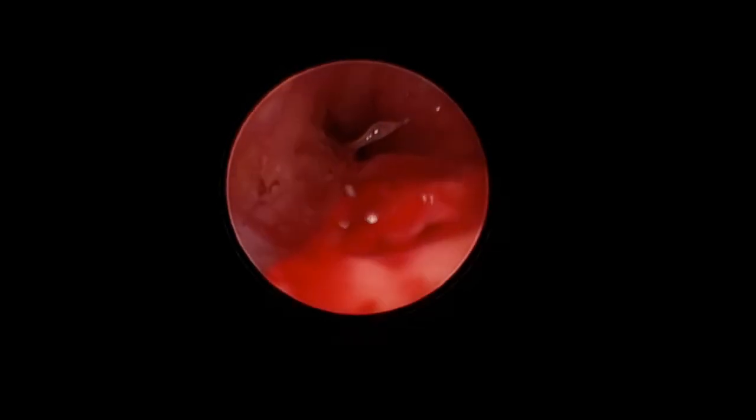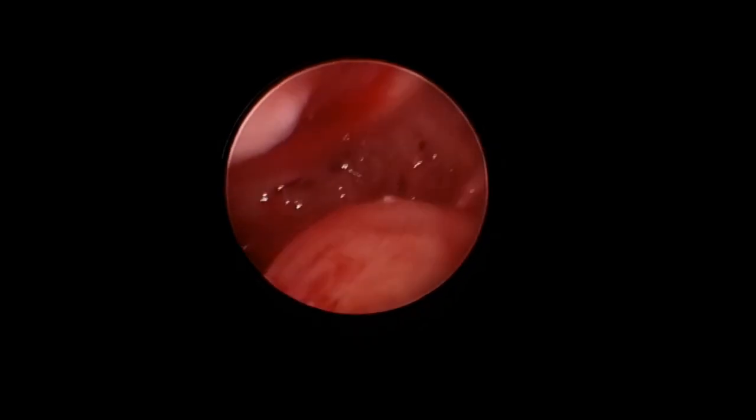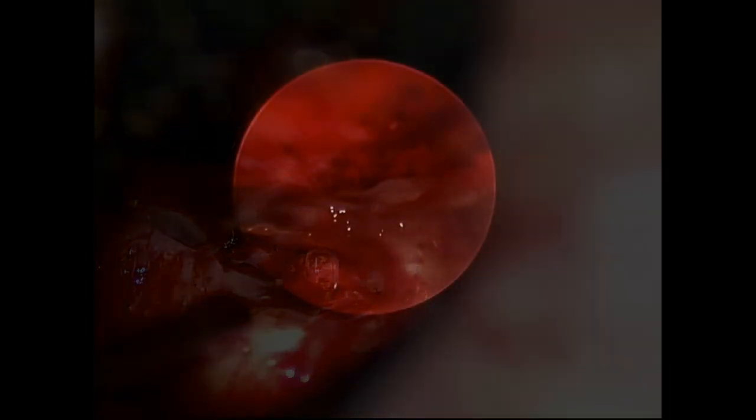There is air there, and there is some reformation of mucosalization. There's the promontory, and you can see the undersurface of the cartilage graft, and you can see nicely into the middle ear and the hypotympanum, and we don't see any recurrence. So now we're going to perform the reconstruction with a PORP, given that we have a normal, intact, and mobile stapes superstructure, but we're going to check its position with the endoscope.